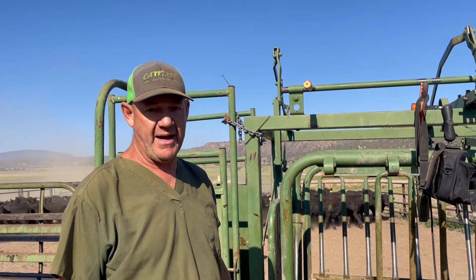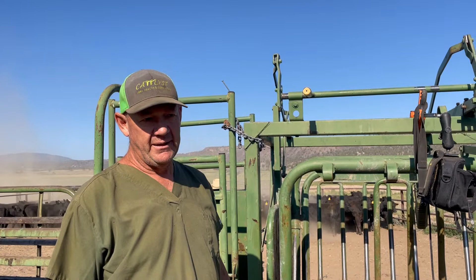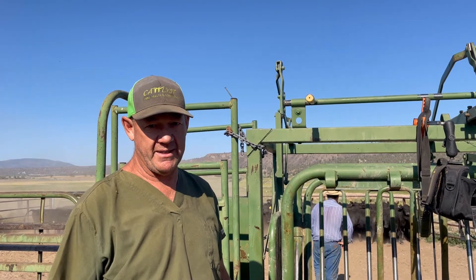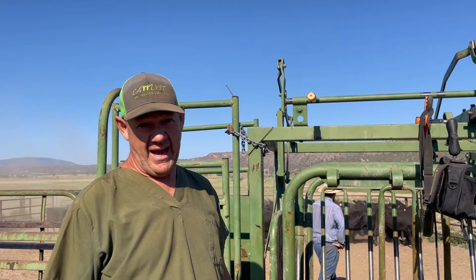A lot of veterinarians say they can preg pretty fast by hand and don't see the reasoning for it. But the truth is we'll do 180 an hour pretty commonly. I've pregged a lot of cows by hand and I'm pretty proficient myself, but I can't do them that fast. The other reason is it's easier on the cattle.